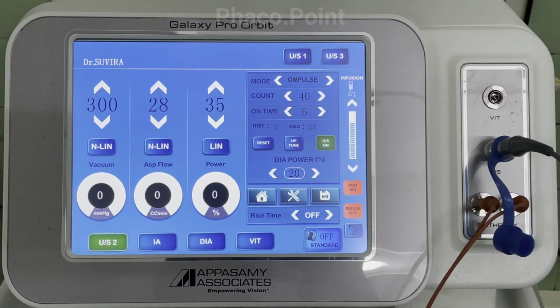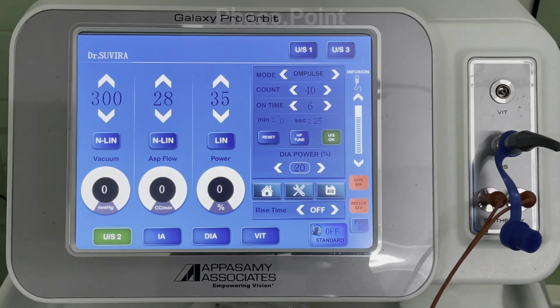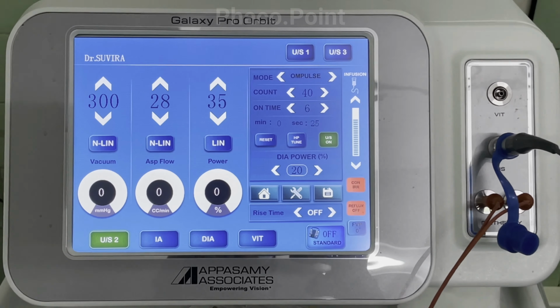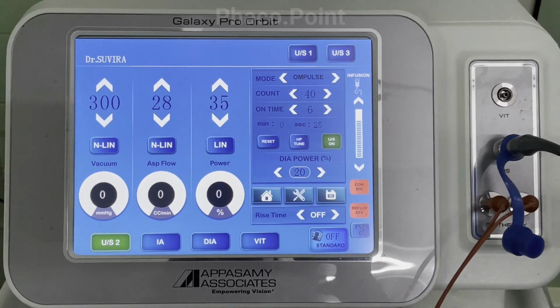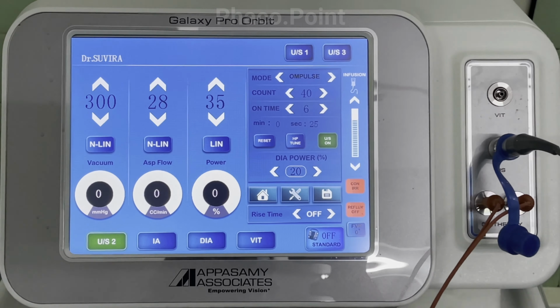So also the flow rate, the rate at which things happen in the eye, is set at about 28 cc per minute, which again is non-linear. That is, at the onset of foot pedal 3, you're giving a flow of 28, which remains 28 all the way up to maximum foot pedal depression.